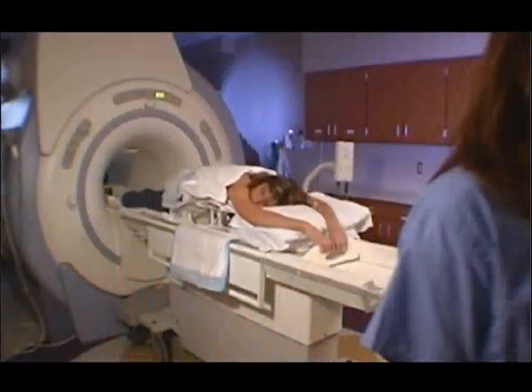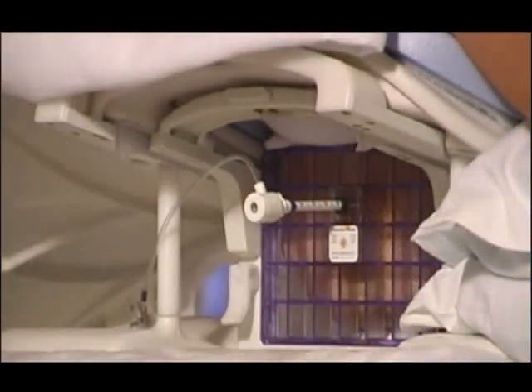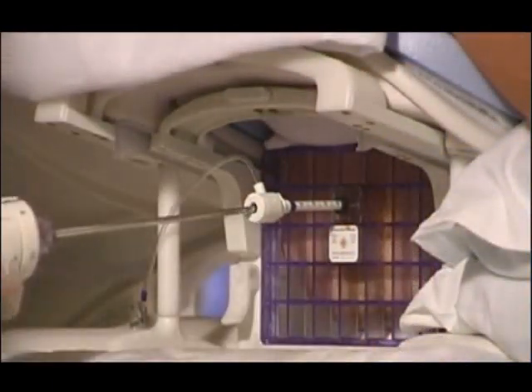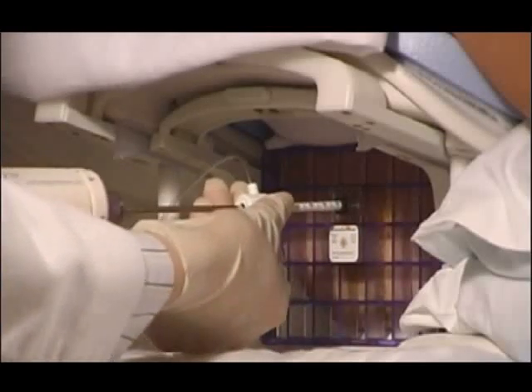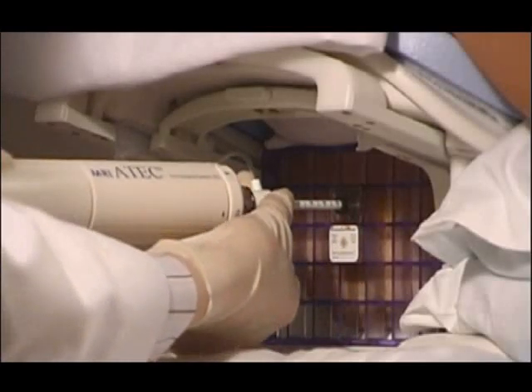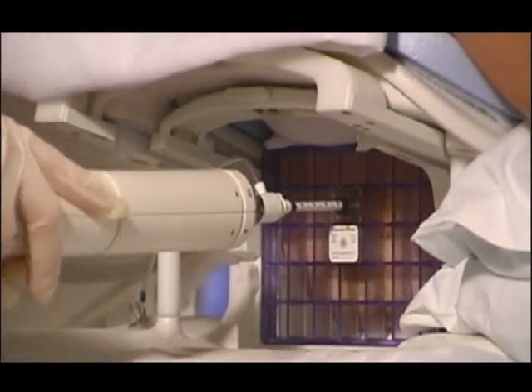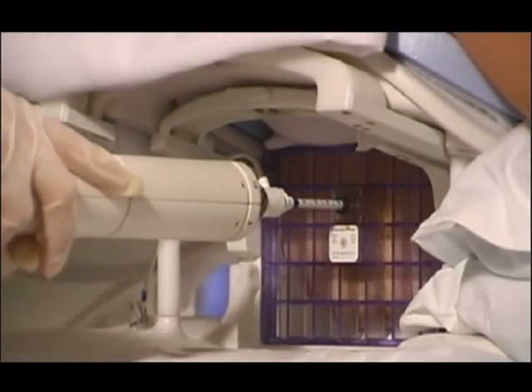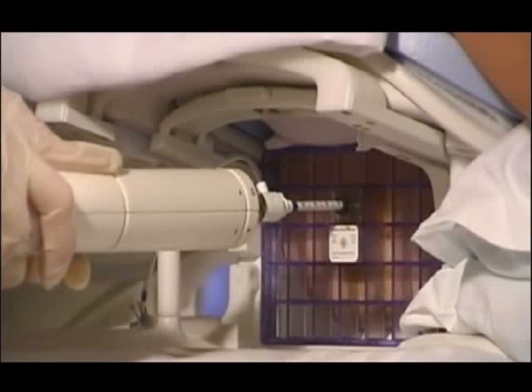The patient is removed from the bore, the localizing obturator is removed, and the ATEC MRI handpiece is inserted to the area of interest for biopsy. The ATEC system acquires a core every 4.5 seconds in a fully closed system.